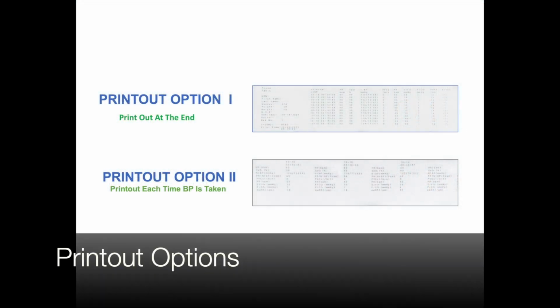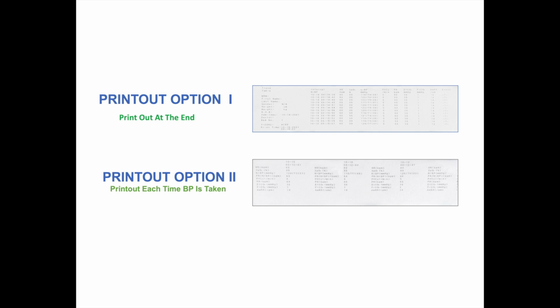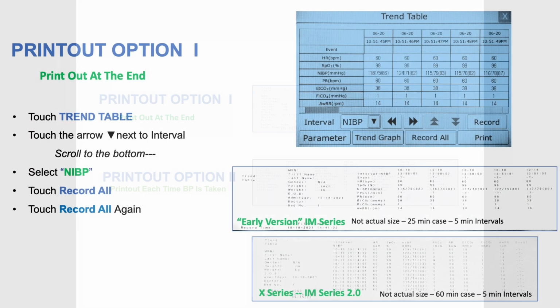There are two printout options: print out each time a blood pressure is taken and printing at the end. Option 1, print out at the end. This is the preferred method since it's the most concise and will use less paper.